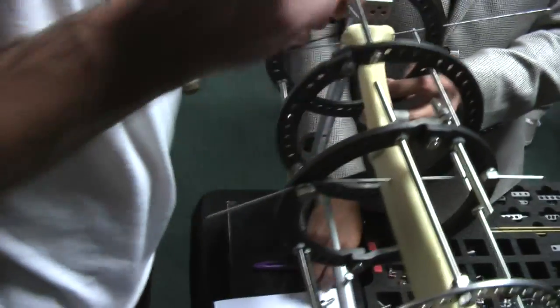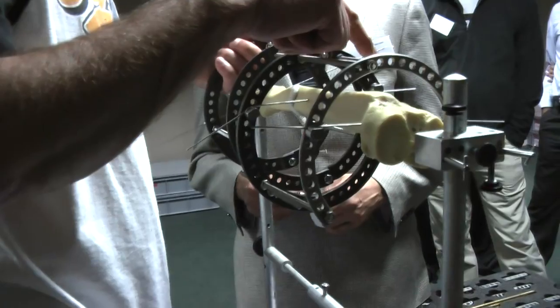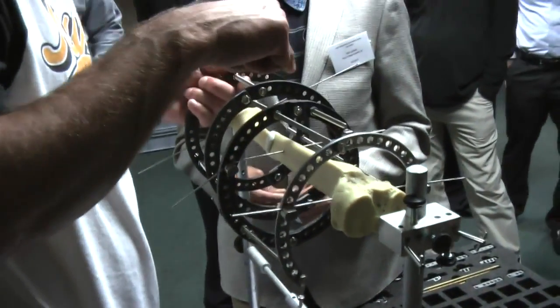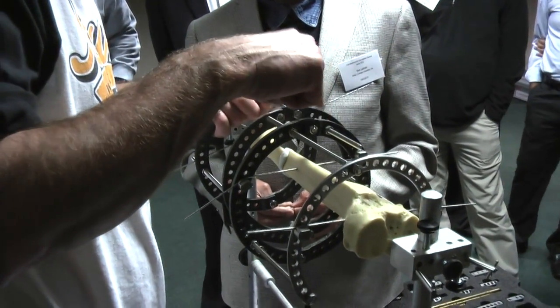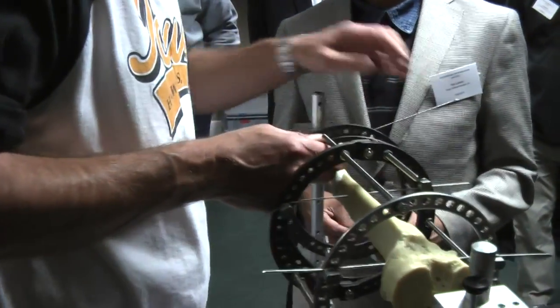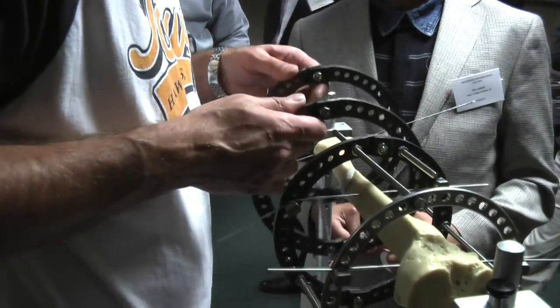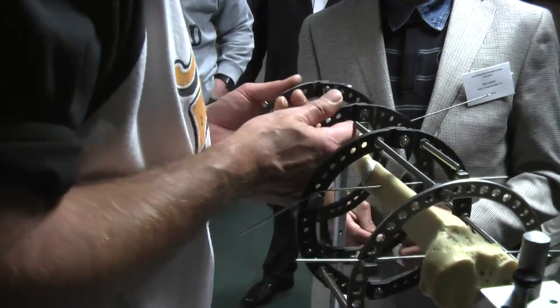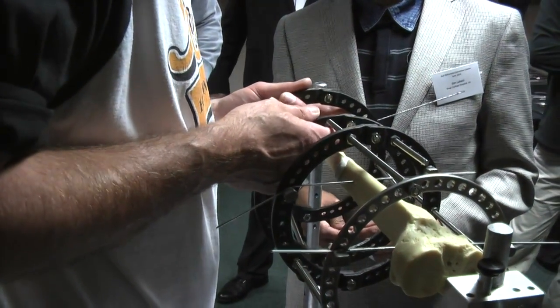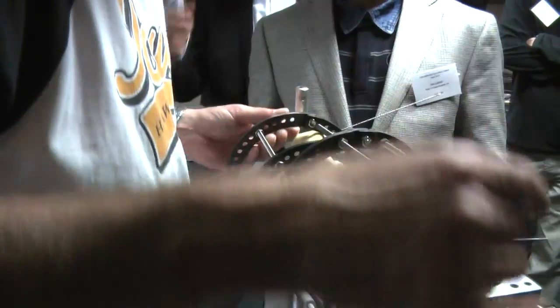Remember, the other thing we said we were going to do was to join this half of the frame to that half of the frame. And we know where that hinge is, therefore we know where this hinge is going to have to go, which is in exactly the same hole as it is over there, which is remarkably just where we've put that rod. Isn't it always? Somebody was asking me the other day why I don't pre-build frames, and the answer is I'm not good enough at building them. I have to dismantle them again. But we're going to have to do something with that rod there, aren't we? We'll have to move it.